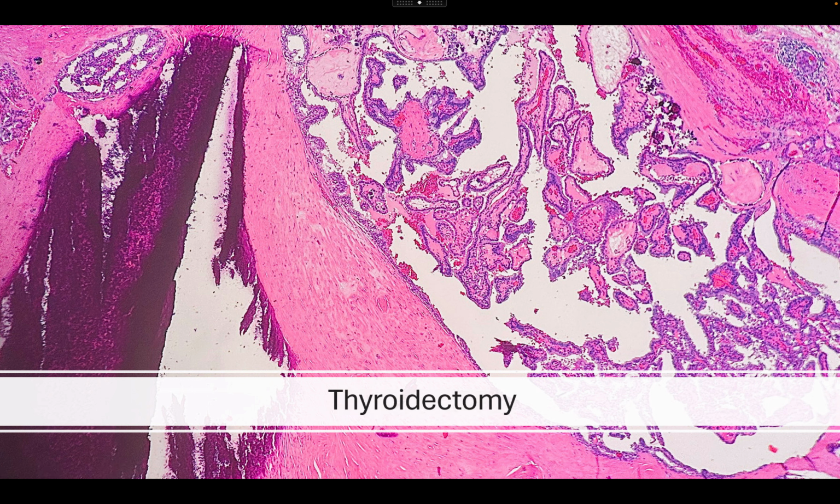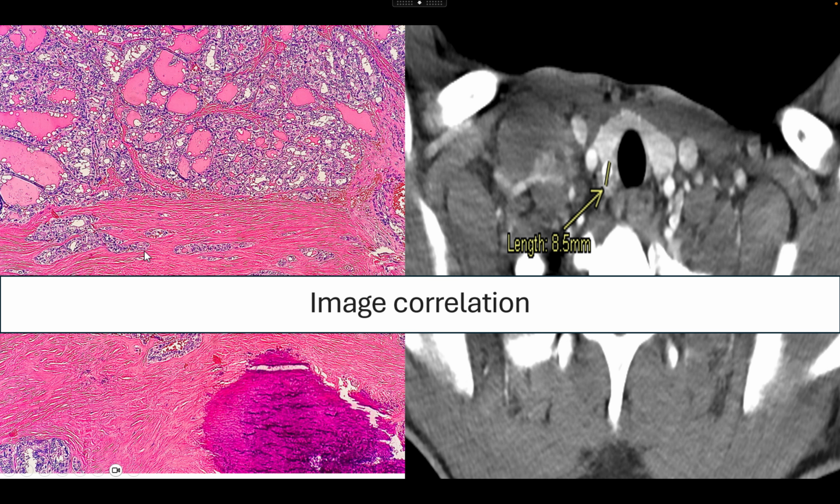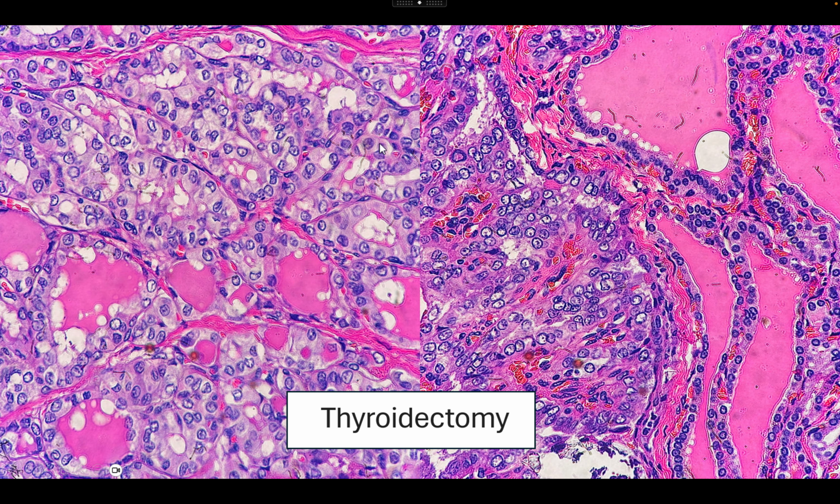And a thyroidectomy was done a week ago. And you can see the image correlation. We had that calcified nodule. You see the calcification here, and these lesional cells. And so this was consistent with metastatic PTC.